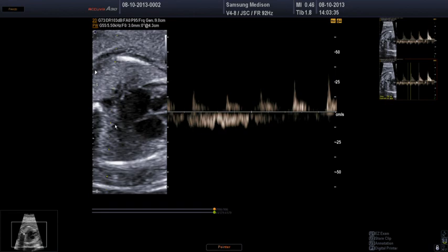And you can access that very easily in a standard 4-chamber view, and you have multiple points of sighting because you have so many pulmonary veins. So it's usually quite easy to get the signal. And this is a very normal signal, and it resembles the ductus venosus Doppler signal in a way. You have your S wave for systole, your D wave, and the lower down here is your atrial systole. And to the other side, you have the pulmonary artery signal, because in here where we're sampling, the artery is going towards the lung and the vein is coming towards the left atrium.